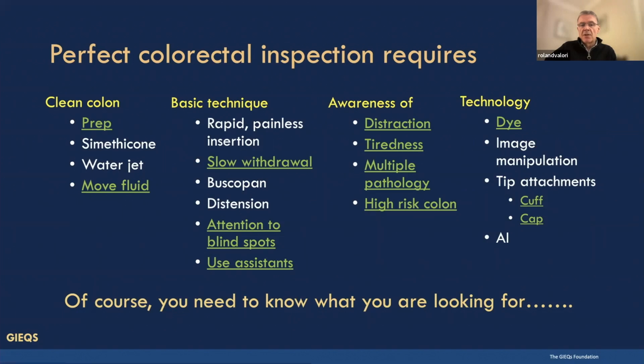We have very low tolerance of bubbles in the colon. We need to get our technique right, and we'll be covering all these things. And I'm really passionate about that third column. We get distracted, we get tired. We're dealing with multiple pathology. Our attention is really being strained.